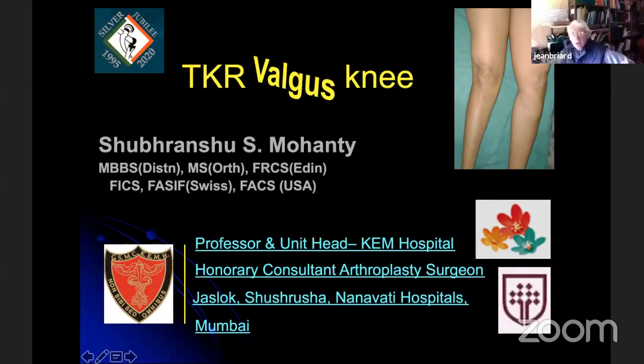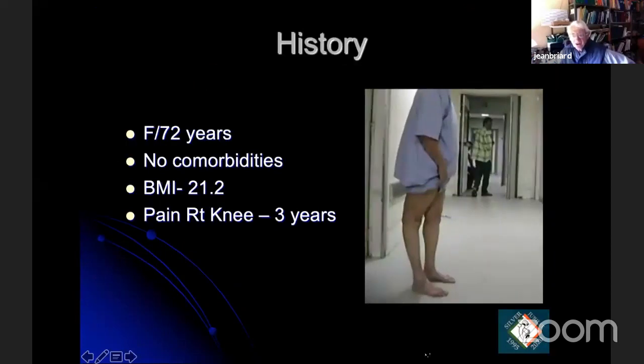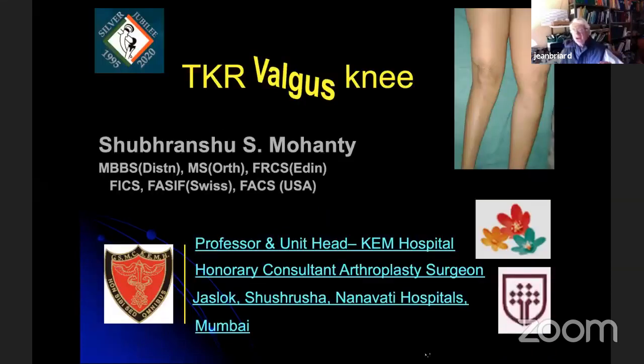Well, I think now we have a classification for this medial laxity. If you have laxity at 90-degree flexion, then you have to use a very constrained implant. If you have no laxity at 90 degrees, then I go in extension. I check, and very often when you correct laterally, it disappears. So the opening you were seeing on the X-ray is not significant. There is no good paper about how to grade the medial laxity. So I put tension on my lateral compartment, and sometimes you have no more medial laxity. That's very simple. If I still have some in extension, then I will augment my medial structures. And then you can decide if you want to use a constraint or not.